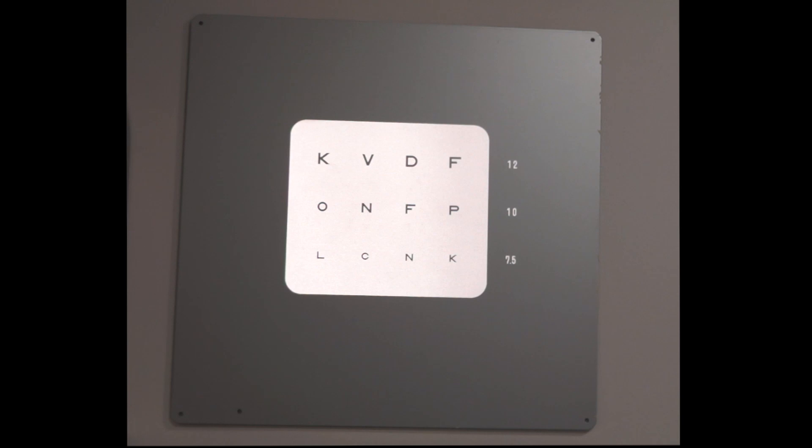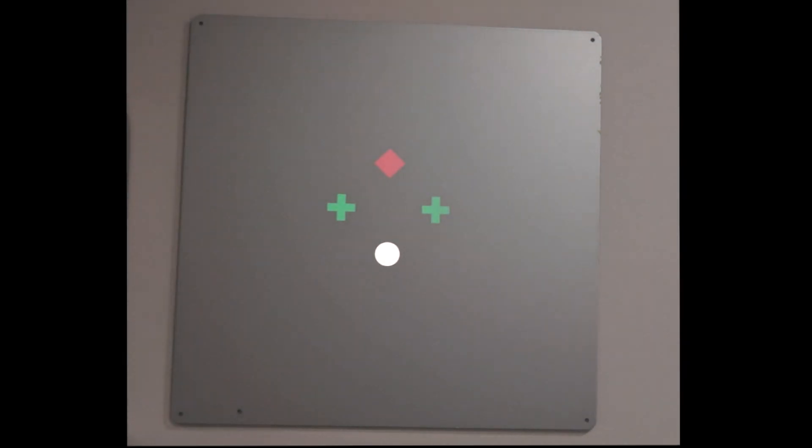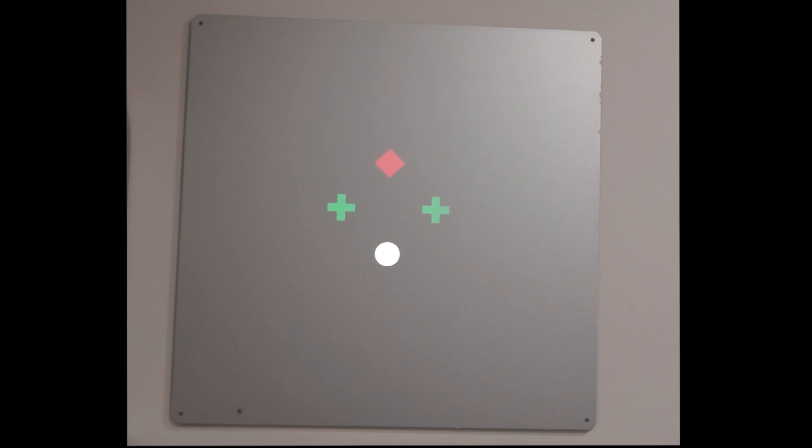And then one of the ways we test this further is to see which eye is suppressing. So this is called the Worth 4 dot test. And on the Worth 4 dot test, there's a red filter in front of your right eye and there's a green filter in front of your left eye.